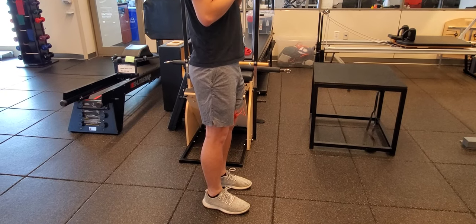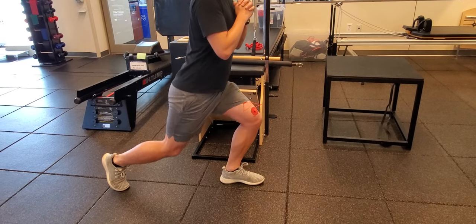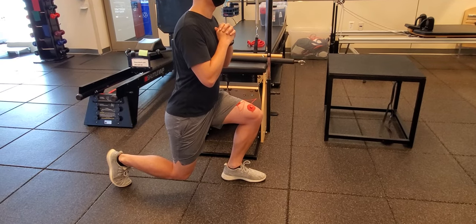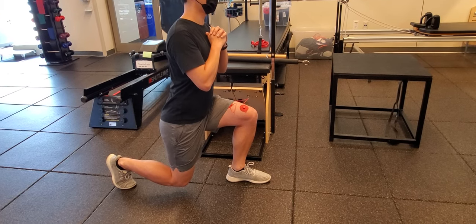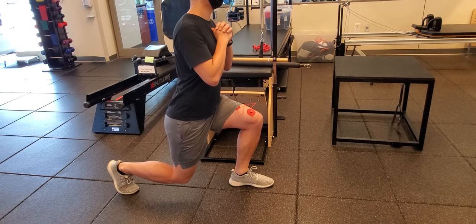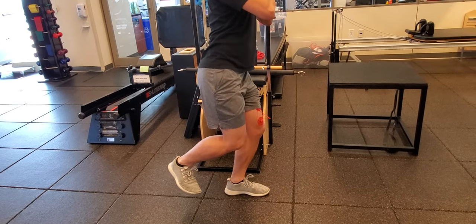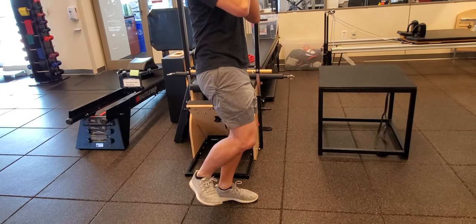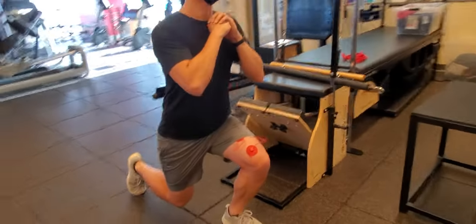Working on the reverse lunge. The front knee is in line with the laces. When you drive up and transition, load through the front leg, straighten the knee, posterior tilt — and then all the way back down.